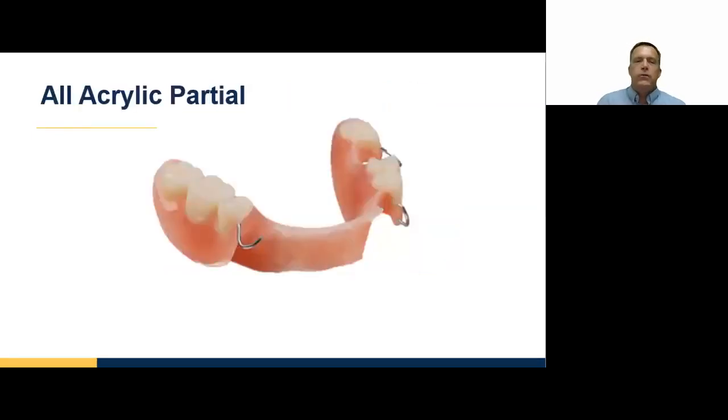All acrylic partial. These seem to have a million names. You'll hear treatment partial, temporary partial, flipper. This is a partial that's made entirely from denture acrylic with no frame. They're usually the most economic, and they're usually not intended for long-term use.